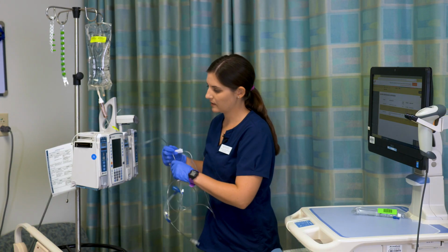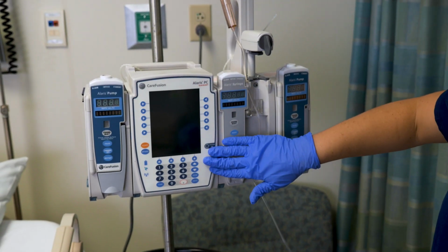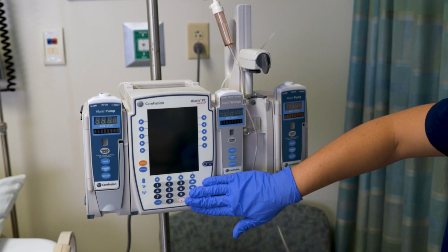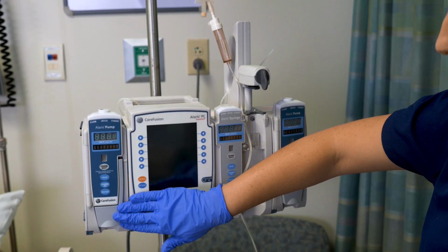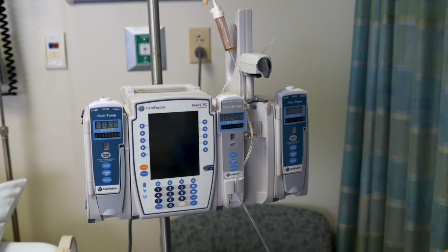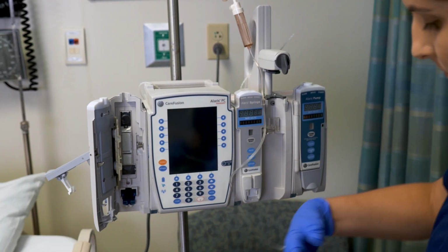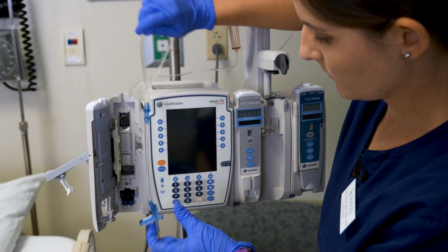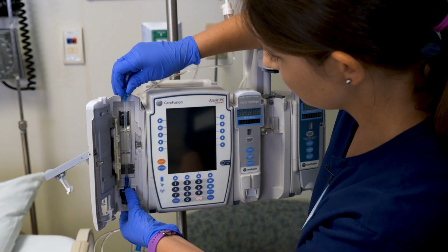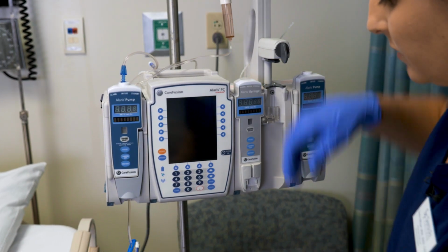I can now go ahead and put my tubing into my Alaris pump. This is the brain or the PC part of the Alaris IV pump. This is where you control your settings. This extra part on the side here is called your channel. That is where we're going to be placing our IV tubing. I'm going to open up this part, slide it in right over here and it clicks, and hold the door closed of the channel and lock in place.